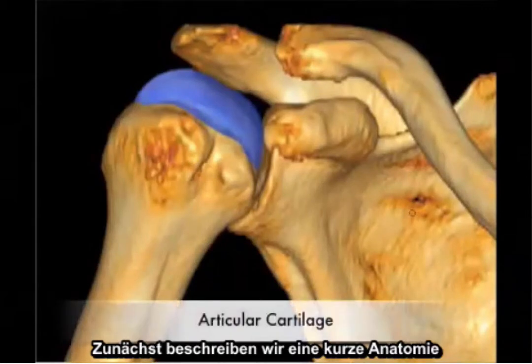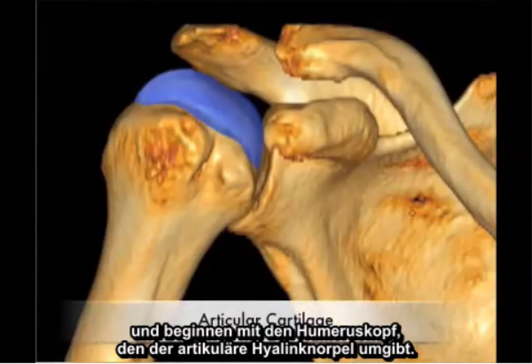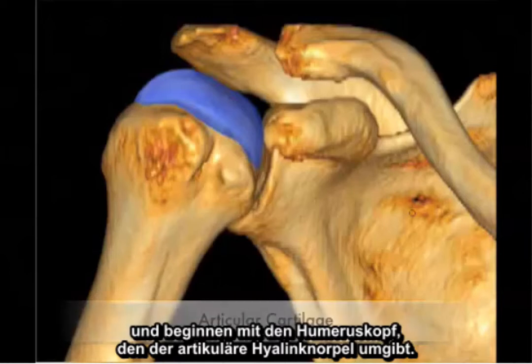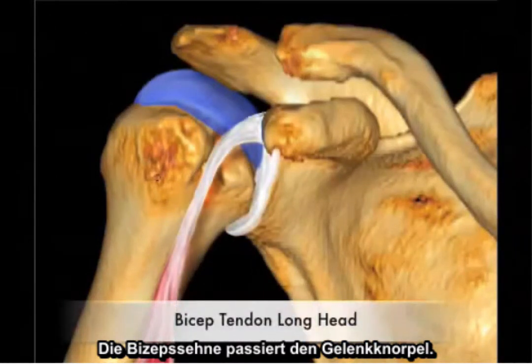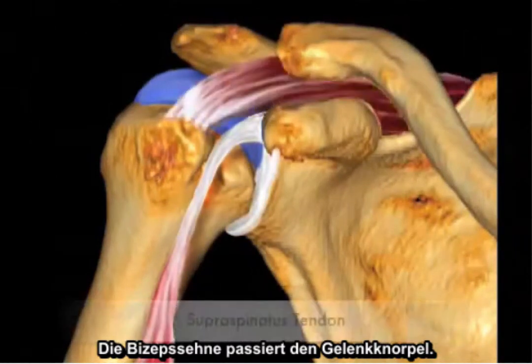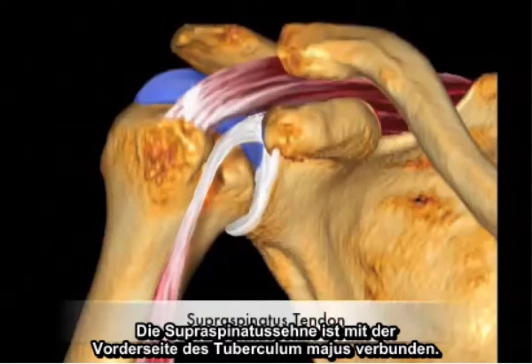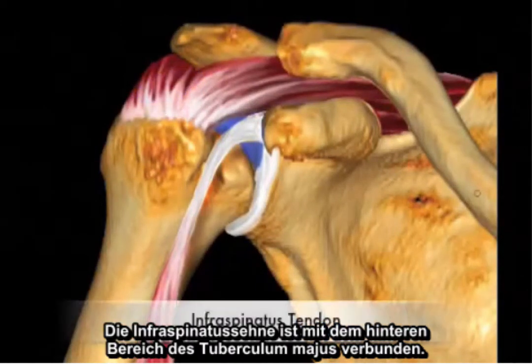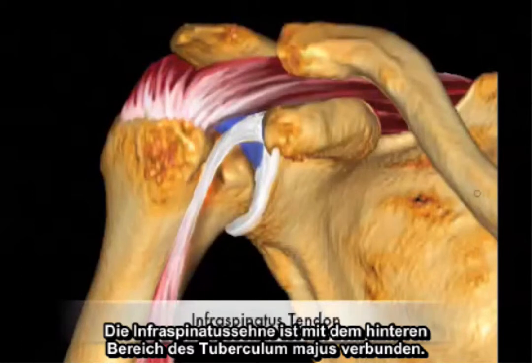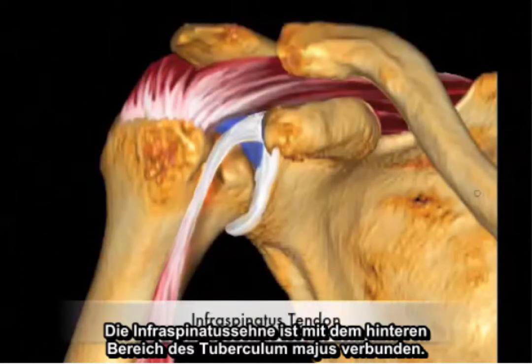First we'll describe a brief anatomy review, starting with the humeral head covered by articular hyaline cartilage, the bicep tendon as it passes through the biceps groove, the supraspinatus tendon as it attaches to the anterior aspect of the greater tuberosity, and the infraspinatus tendon as it attaches to the posterior aspect of the greater tuberosity.